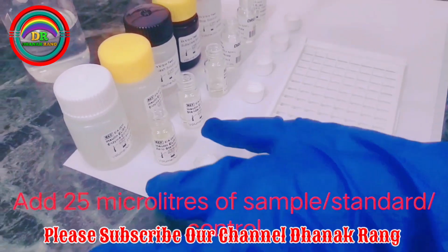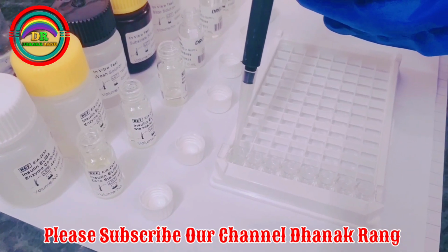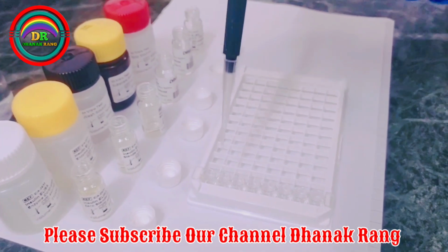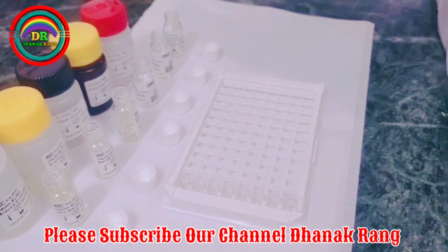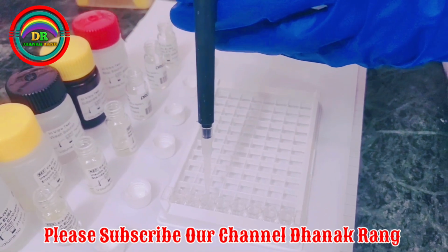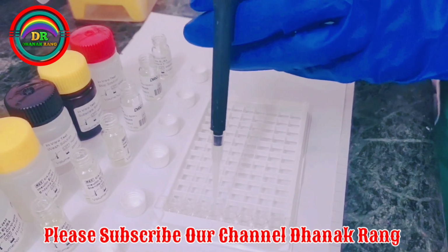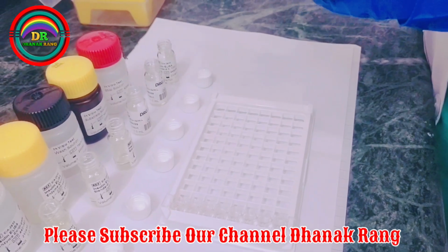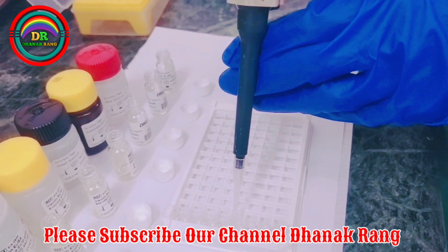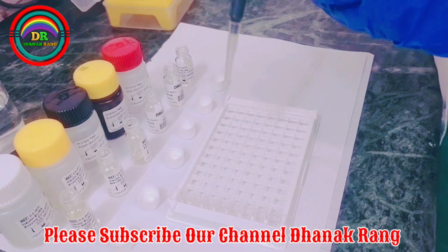So now we are taking the standard 0, 25 microliters, standard 1, standard 2, standard 3, standard 4, and the last standard 5.